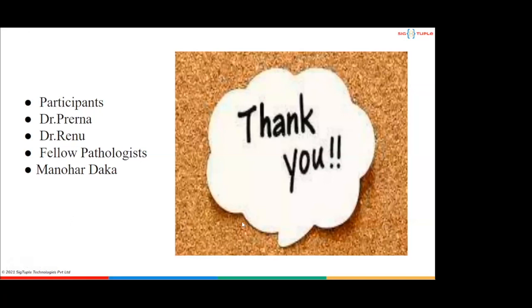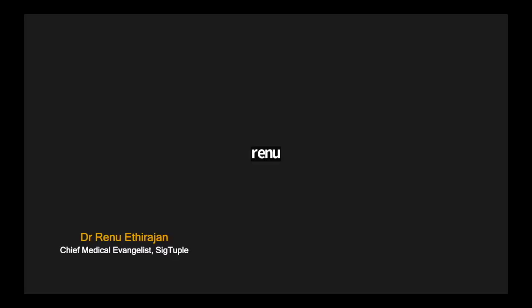And the take-home message, as usual, is about digital pathology solutions, which is very much the future, and so much in our practice today. It's already there today, which everybody is using. And we hope to take this forward on a regular basis.